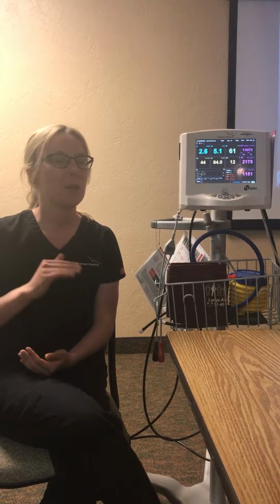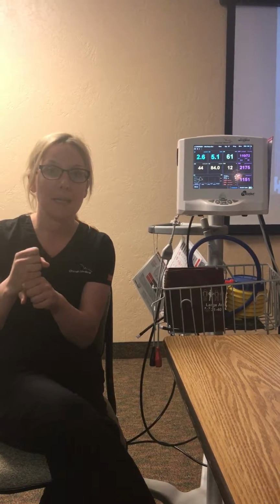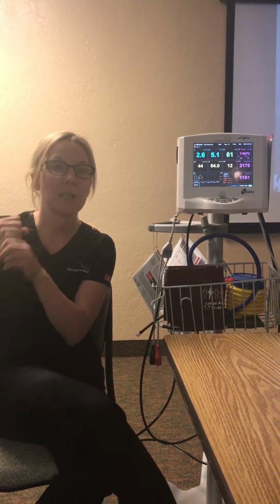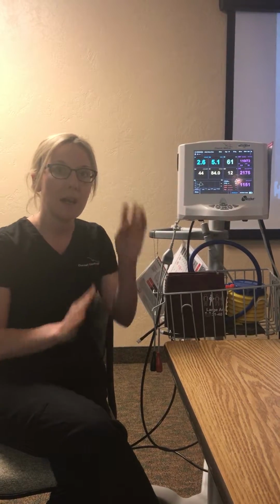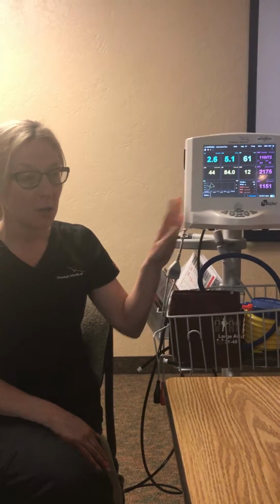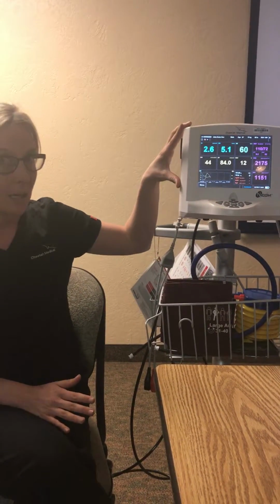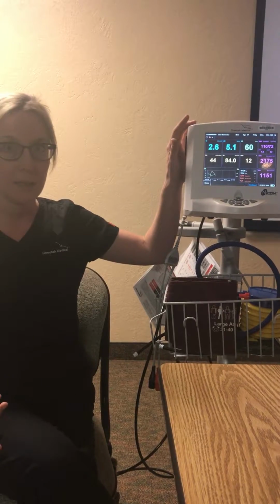I can have a patient with a good blood pressure while everything else is going down the toilet because I'm just trying to overcompensate to maintain. By the time my pressure is low, the damage is already done. We're going to find those numbers on here showing inadequate perfusion before blood pressure. So we're going to talk real quickly about the three components to flow or hemodynamics: preload, afterload, contractility.